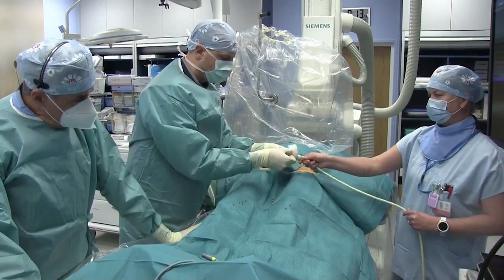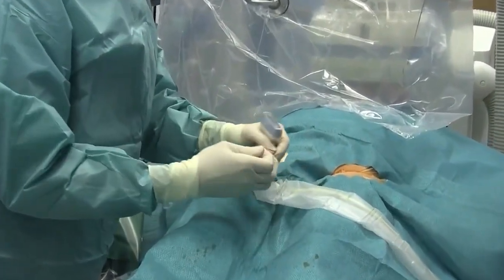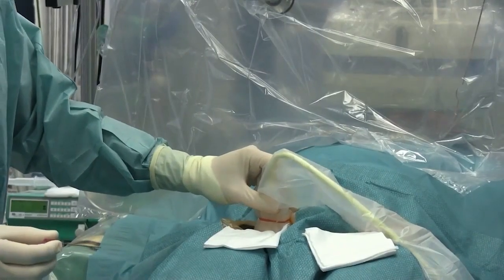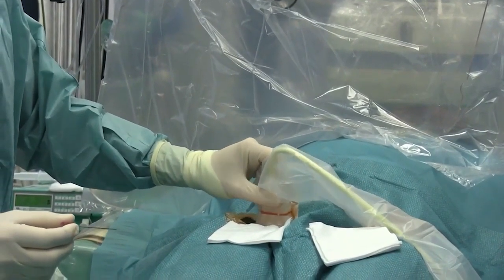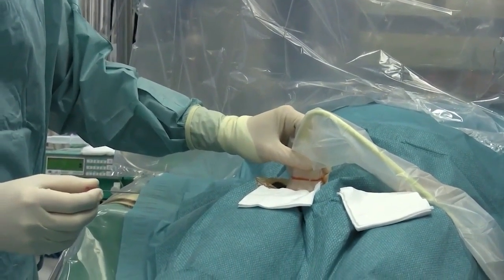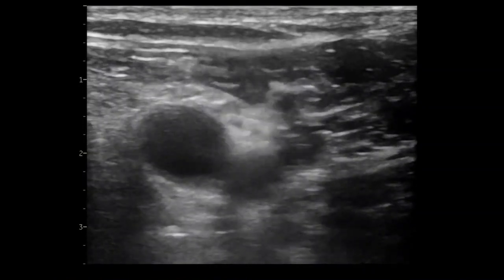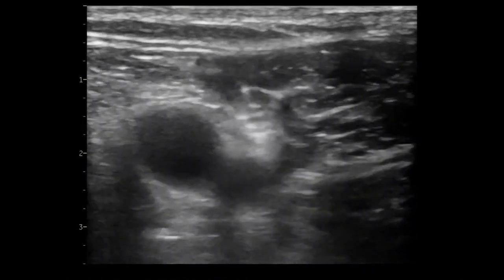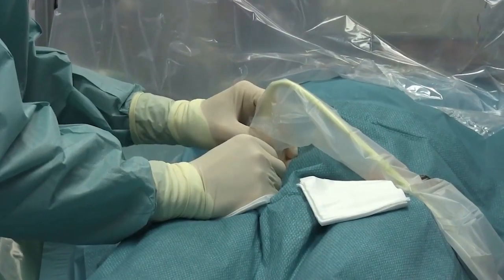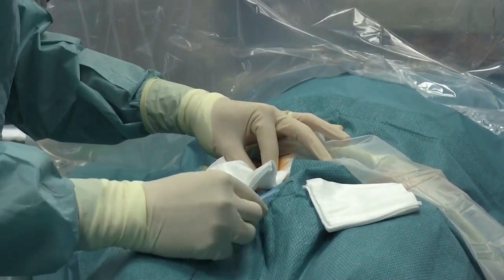After induction of general anesthesia, vascular accesses are obtained by ultrasound guidance. In general, ultrasound guidance is recommended, especially as large-bore cannulas like Faradrive sheaths are being deployed. A linear probe with sterile cover is used. Artery and vein can be easily differentiated as vein is fully compressible. Once vein is punctured, a long wire for transeptal sheath can be inserted.